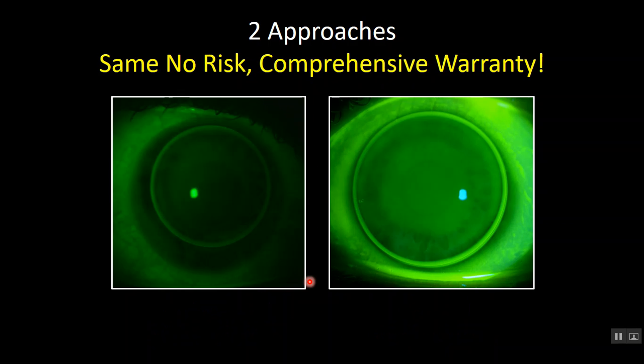Now you have 2 approaches, the simultaneous vision lens and the centered simultaneous lens. So slight translating superior centered lens or the very centered simultaneous vision lens.